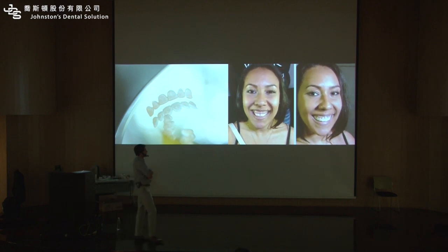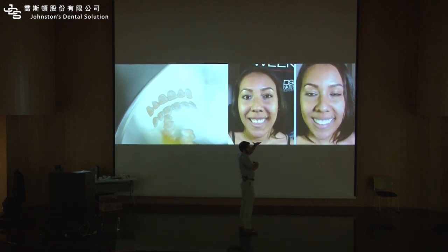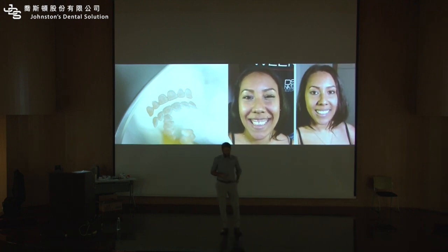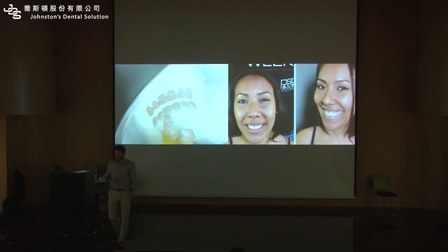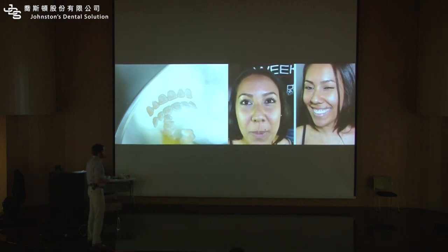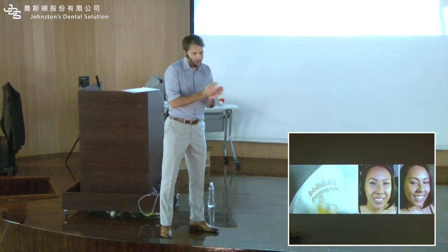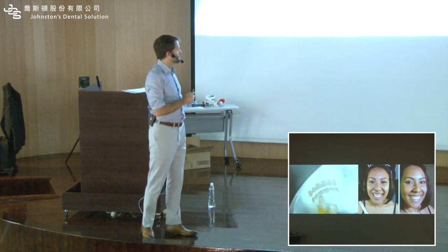So when she saw herself with this, even though theoretically orthognathic surgery would be ideal, she saw this and said, that's good enough for me. That's great. Crown lengthening, veneers, I'm fine. Okay? So you have the 2D simulation, you have the mock-up test drive, and then you go for the treatment.